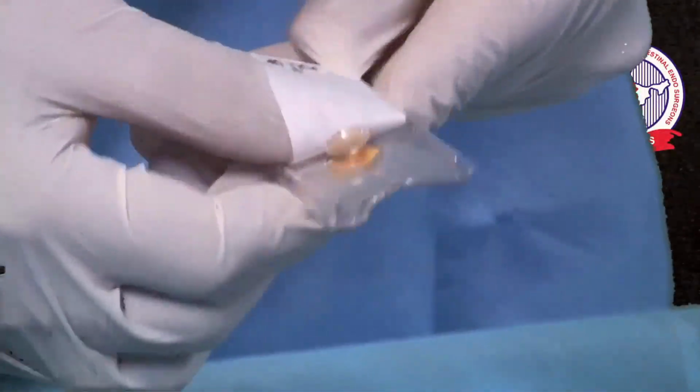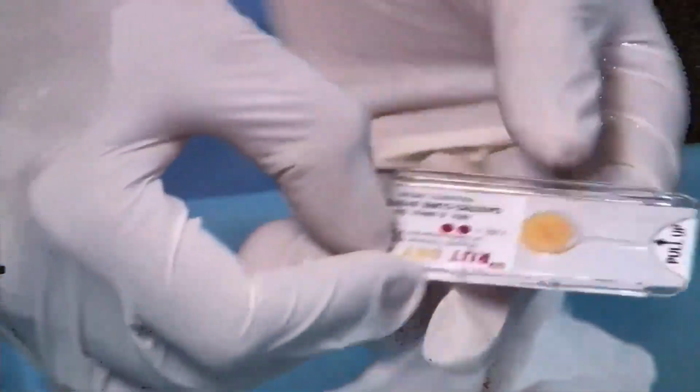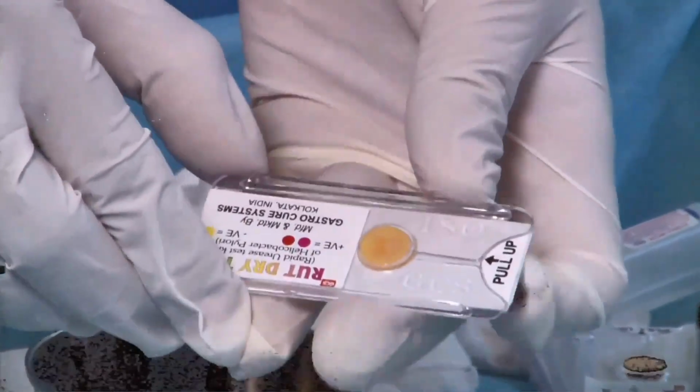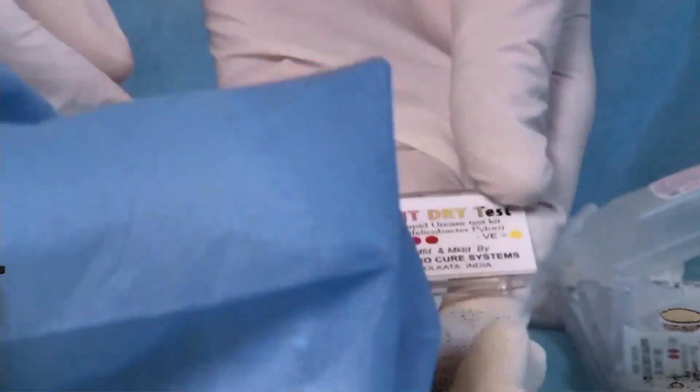Then pink is positive. That is the very quickest way of seeing whether the patient has a urease enzyme even present. If it is second time positive, whatever drug you have given didn't work or she didn't take. So you need to do further test, even consider doing culture and all those things. So that's about the very simple rapid urease test.